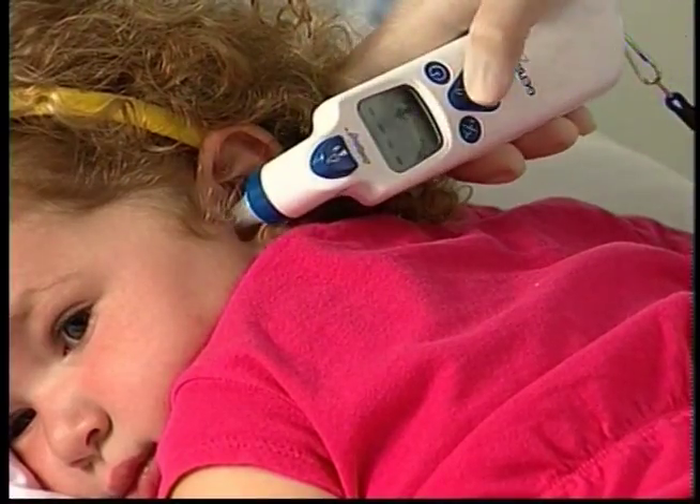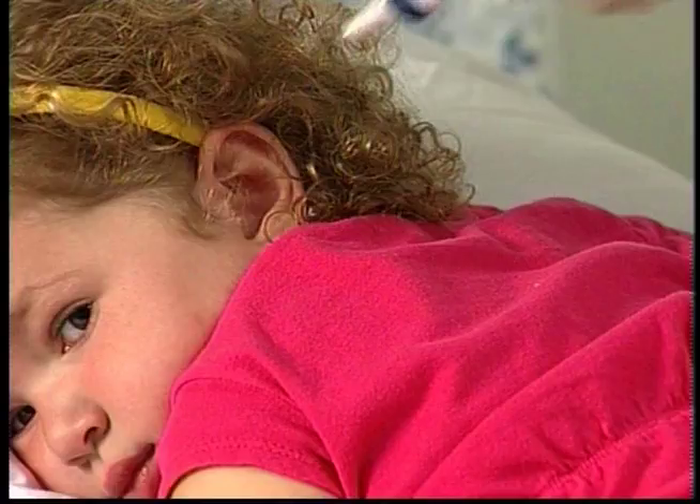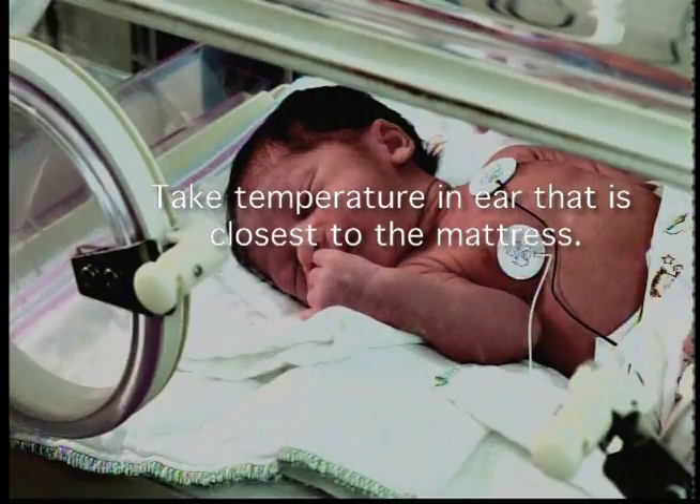If the patient is lying on their side, always use the upper or exposed ear to obtain the most accurate reading. Neonatal patients in special warming environments such as incubators, isolettes, or radiant warmers should have their temperature taken in the ear that is closest to the mattress to reduce the effect of the artificial heating devices on the tympanic membrane.